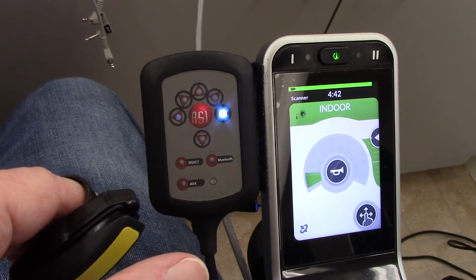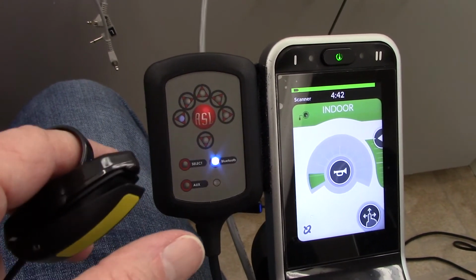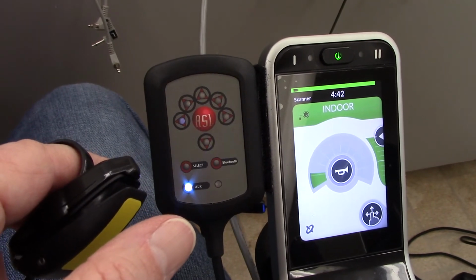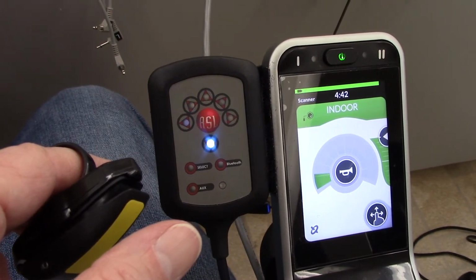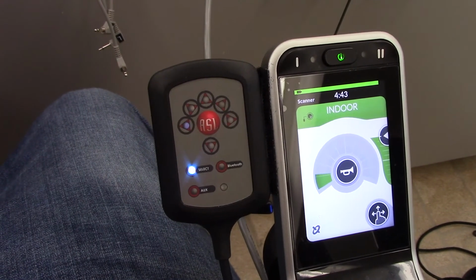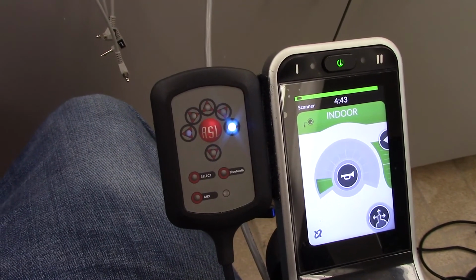Okay? So that's what it's like to drive with it, to move into Bluetooth and run a phone or an iPad or something that you're using through like a mobile device. And then also get into that auxiliary port and access something cabled. Okay? I hope this was helpful.